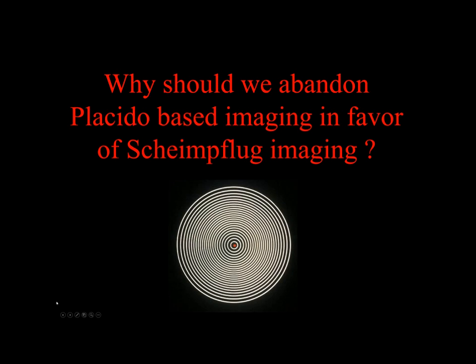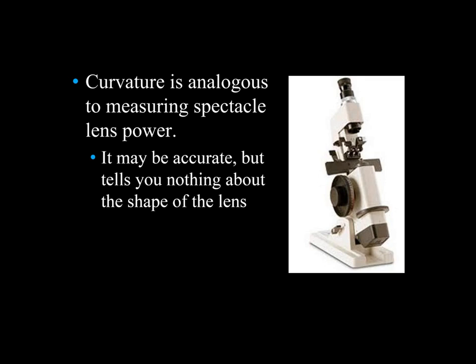Okay. Well, first of all, what's the difference between elevation-based tomography and Placido-based topography? And is there still a need for Placido imaging? Well, curvature is produced from a Placido system, and the problem with curvature is that it doesn't really depict shape.